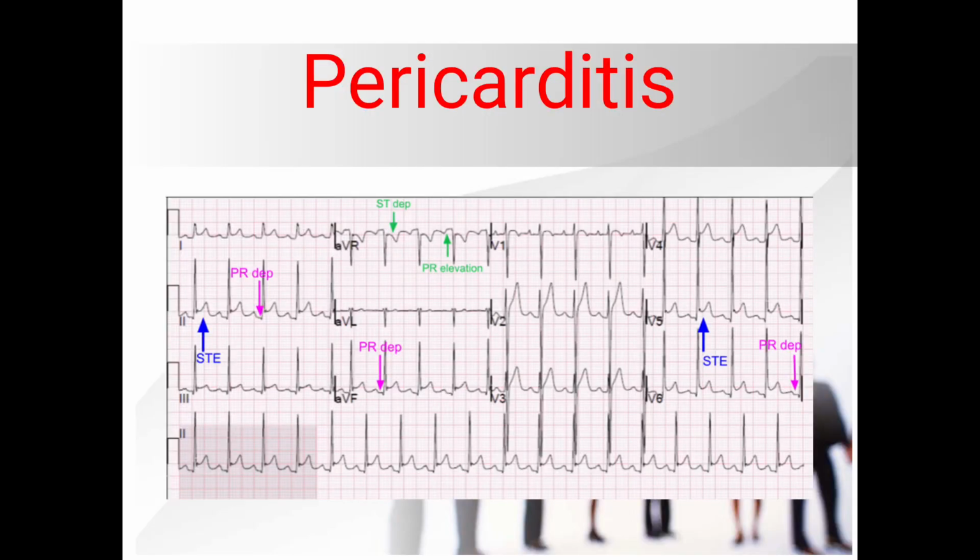In this series of ECG basics, today I will talk about pericarditis and the ECG changes in pericarditis.